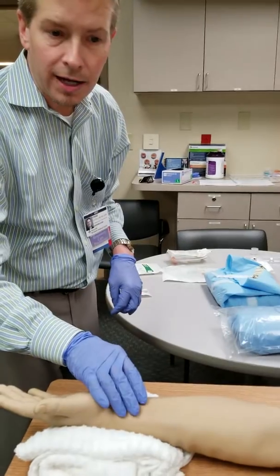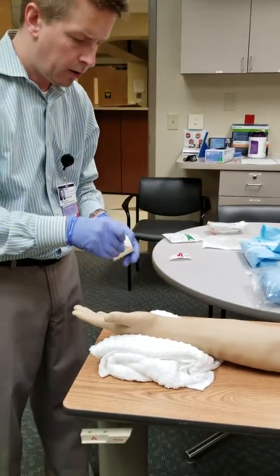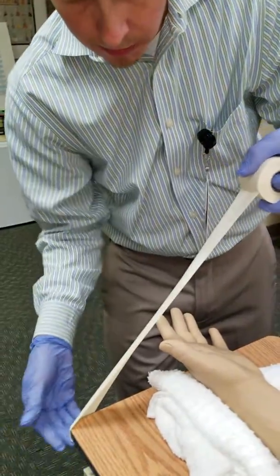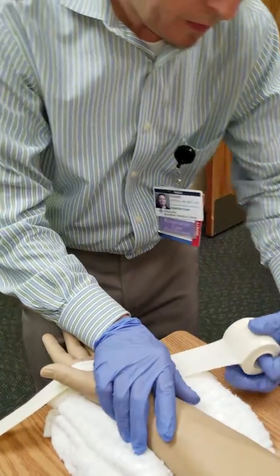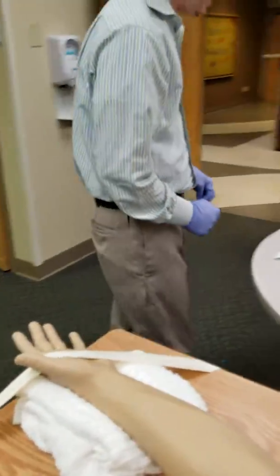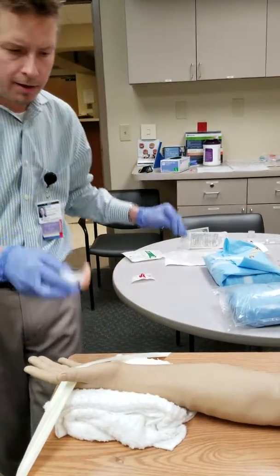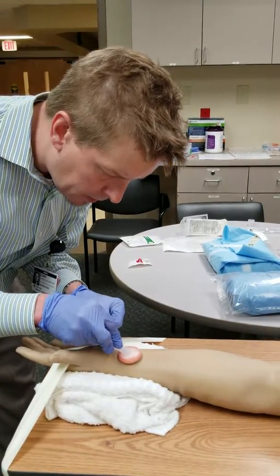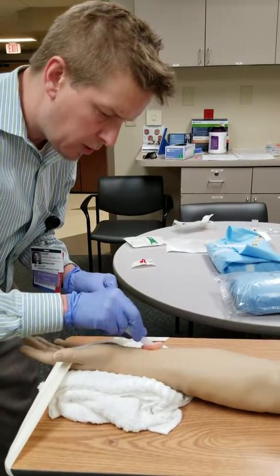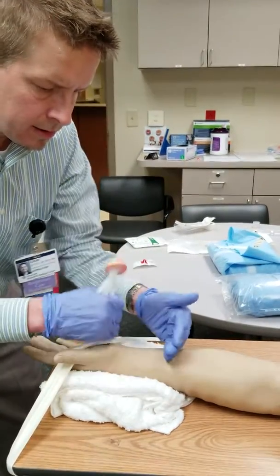We've performed the Allen's test to ensure good collateral flow. Now we're going to use this foam tape to secure the arm — let's put that right there in between the thumb and roll it over. That is not going anywhere. Now we can go ahead and grab our Chloroprep — we pop it, start at the insertion site, going slow in little circles, then larger circles. We want to create a clean area about like this.